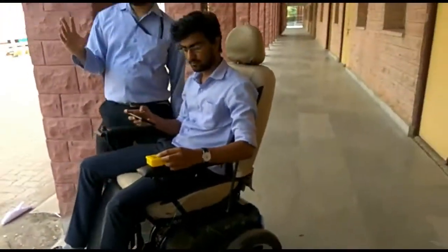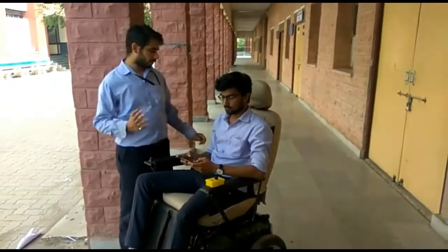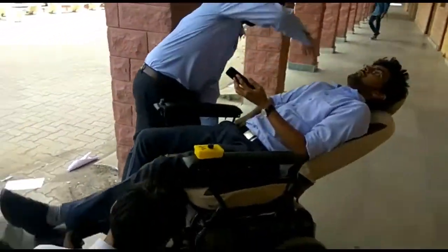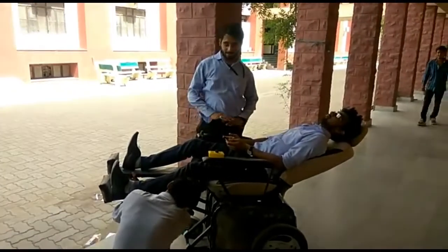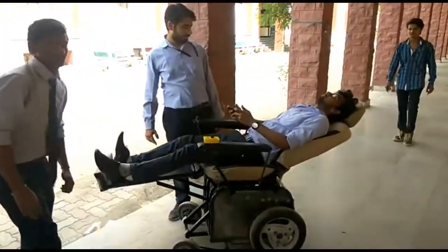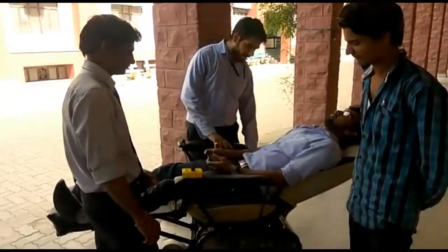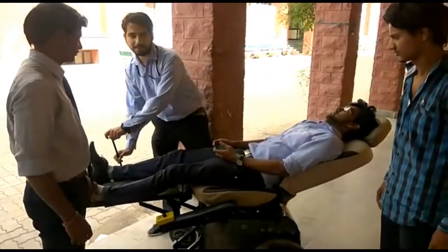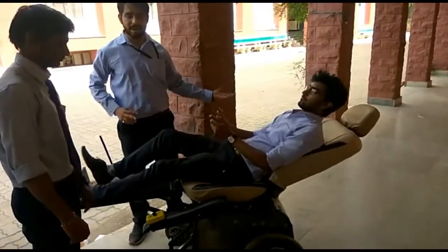Now, the thing that makes it smart — there is a mechanism provided to convert it from a wheelchair to a bed. So if someone wants to rest, he or she can rest on it. We have provided an adjustable hand rest which can be adjusted. If someone wants to shift to a bed, they can turn it around and shift it to a bed, and vice versa.